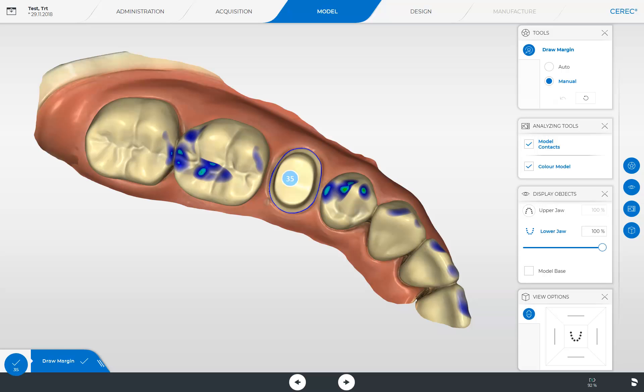Upon arrival in the model phase, the final calculated 3D model data are displayed for the first time. For demonstration purposes, we have already opened all functions in the side panel, and we start by explaining the tool palette.